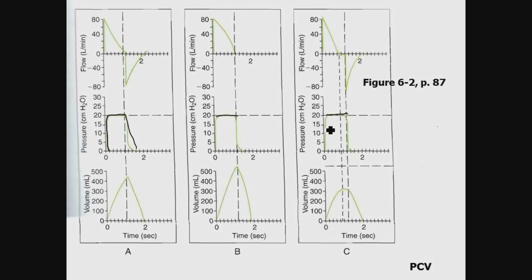Well, there is some shape to it there. The way that I always draw it is truly as a square, but we can taper that. We can fiddle with that, and that'll be the fall. But the same general idea: I rise to my target pressure and I stay there for an inspiratory time.